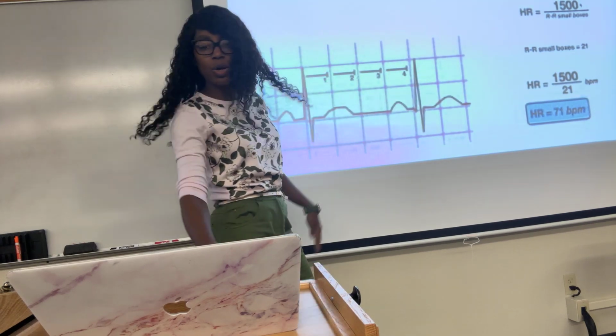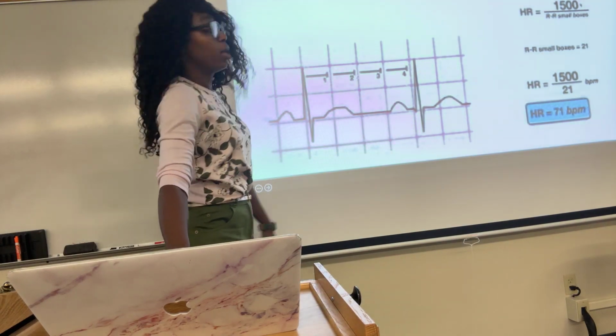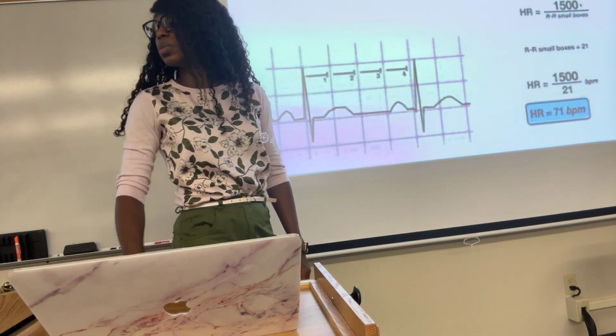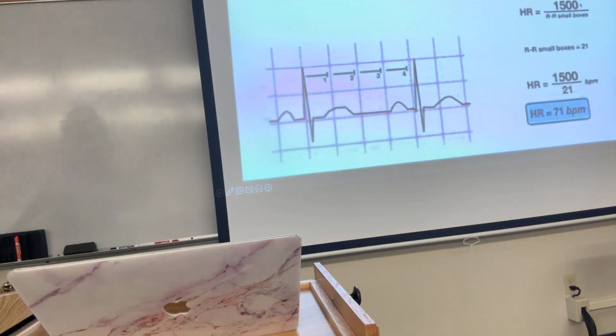And so then once you put that down, then you have to say, let's see. So 5 of the small boxes, or 5 of the large boxes, is 1 second. So what do you say? 5 of these, 1, 2, 3. So those are the small ones.